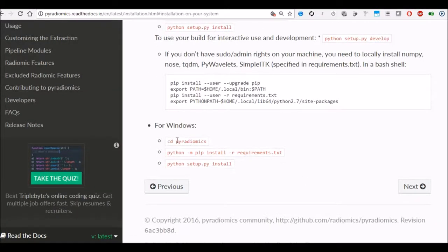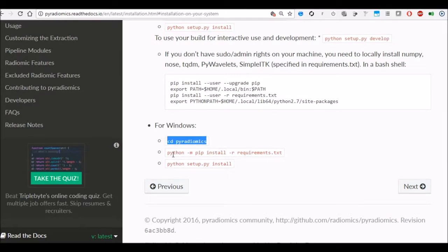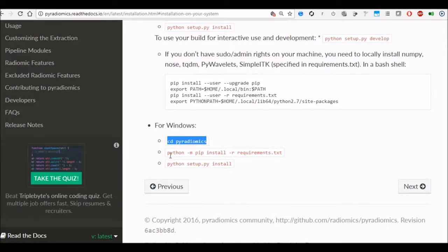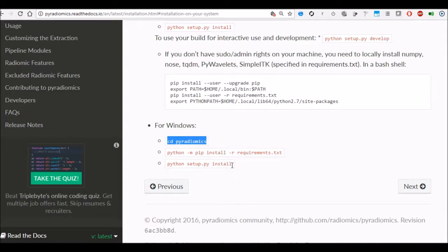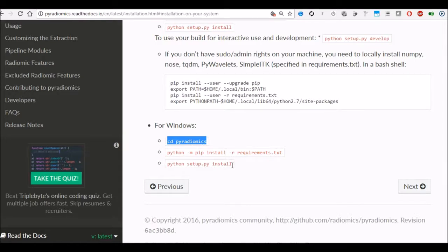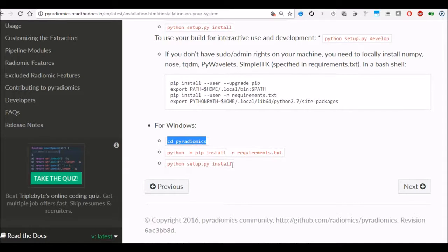So once you have installed PyRadiomics files you can go to the directory cd PyRadiomics and then if you want to use Python for installation and setup you can use the commands specified by PyRadiomics website where you will use pip to install all the requirements and then you will set up and install. So this is a fairly long process as it installs various packages such as numpy and others and during this process on Windows 10 machine I ran into a whole bunch of problems and it took me over two days to resolve them. Ultimately I gave up and looked for alternative solutions for Windows 10.